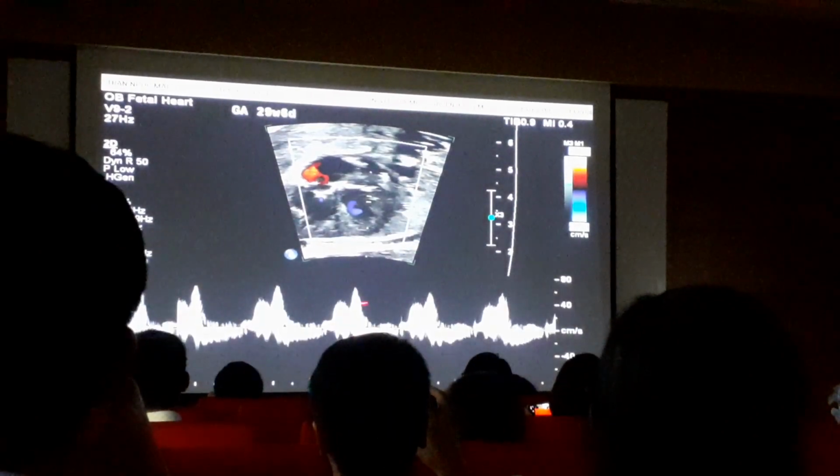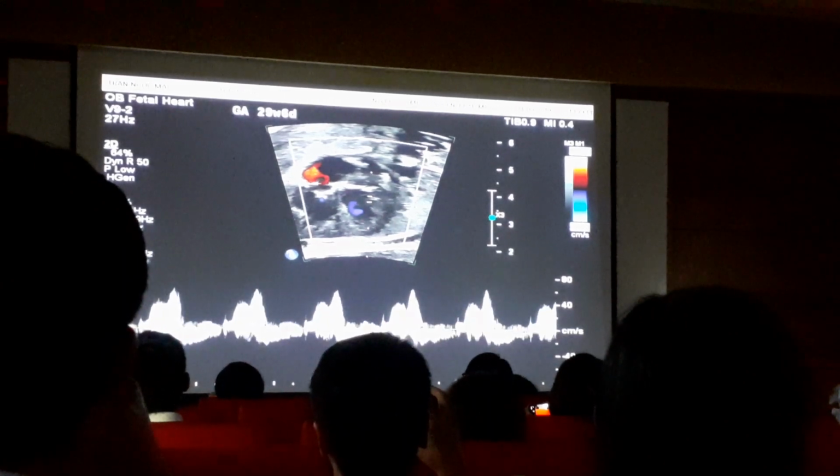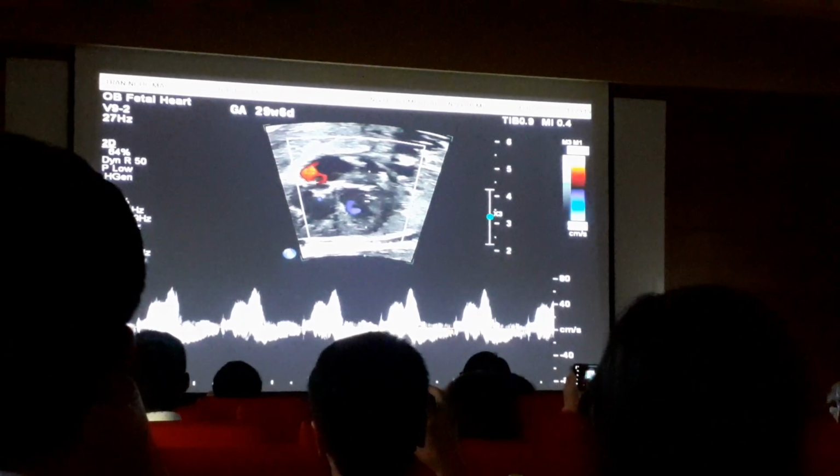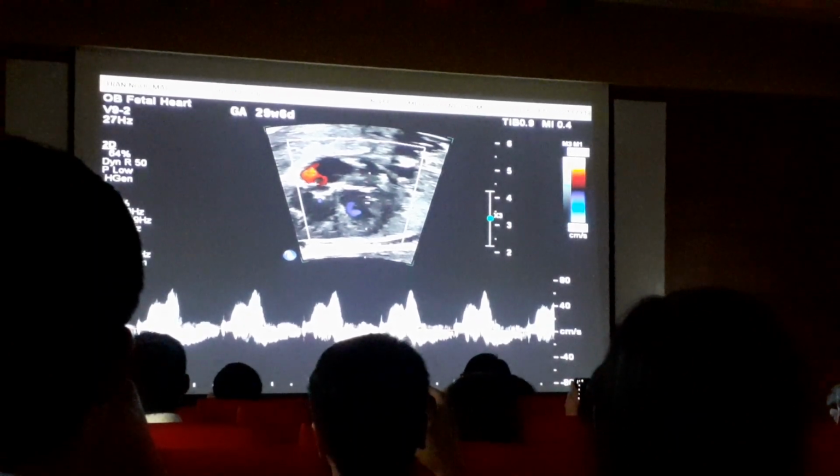In comparison, the mitral is unaffected. The mitral valve is completely unaffected; we see two very clear peaks. So hopefully you can see the difference there.